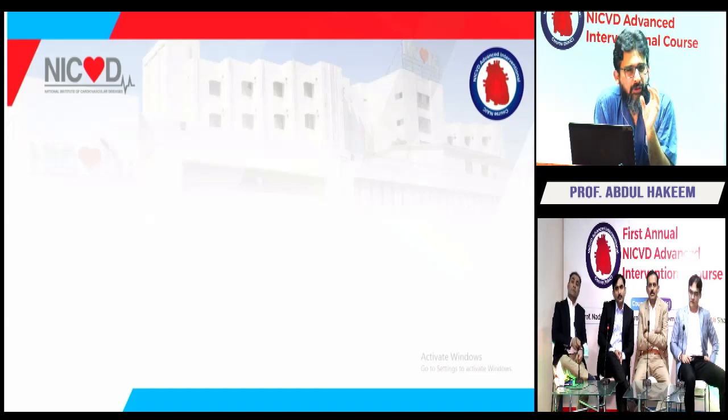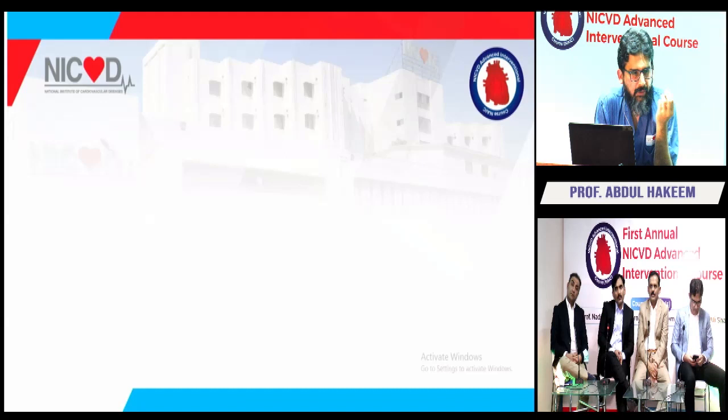And so if you have a nodular calcium, there are two or three issues. The most common that's going to happen is you'll have PVL, okay? That's the most common nidus for paravalvular leak. And then if you get too aggressive with post-dilation or with balloon expandable, which would be a relative contraindication, you could cause an annular rupture.